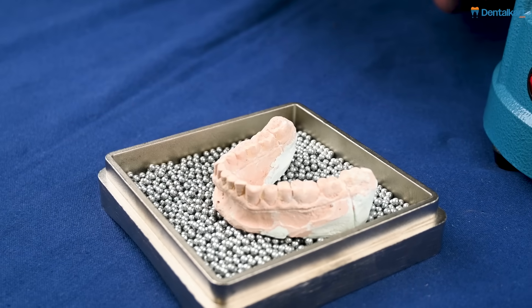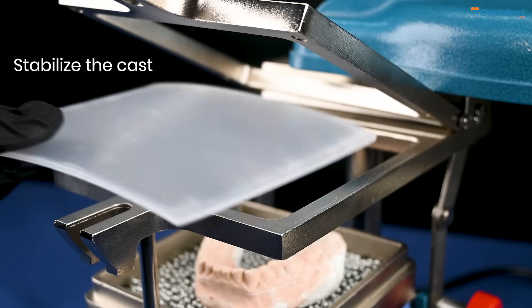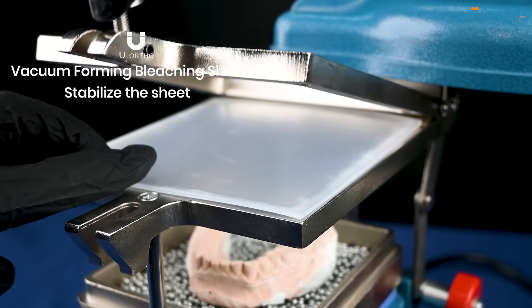For this example, we will be using a facial cast. Once we have stabilized the cast, we stabilize the sheet that we will be using.